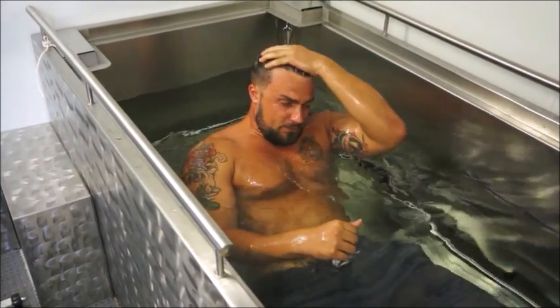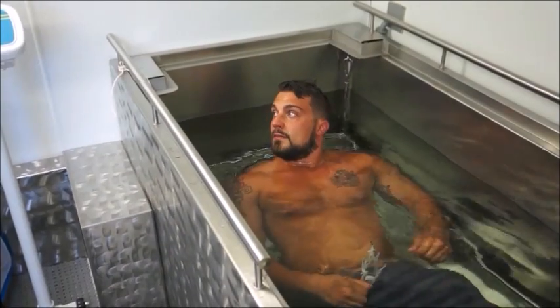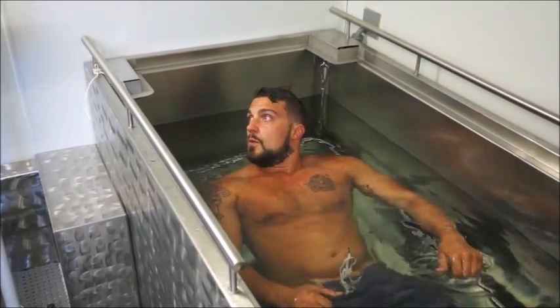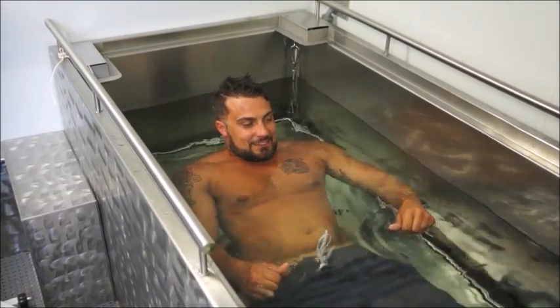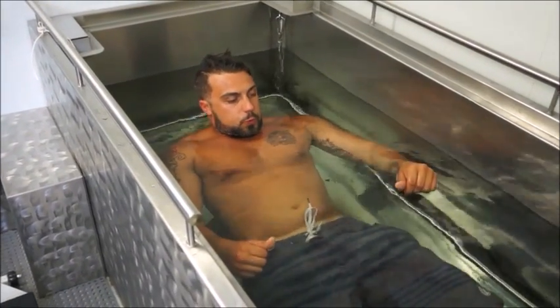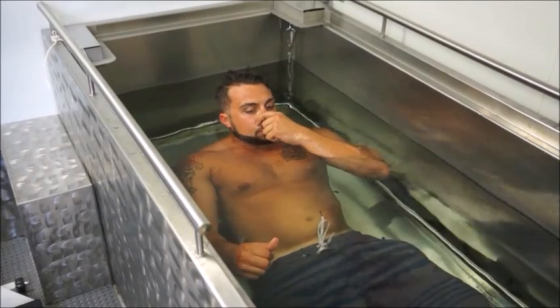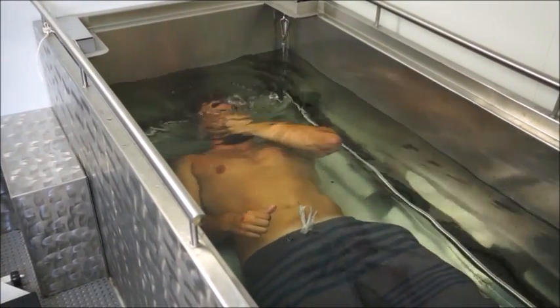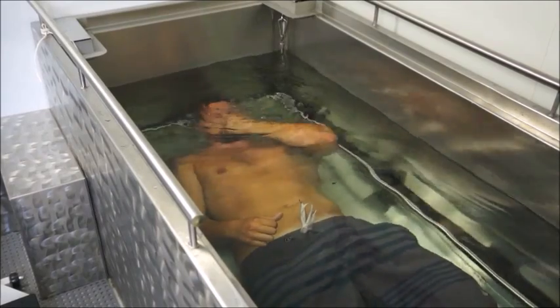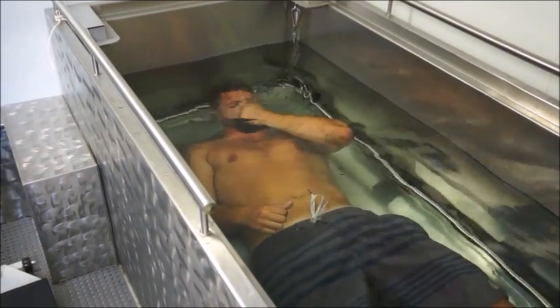Good. How did you feel about that? Good. Do you need any more air out? Yeah, I'll try it one more time and get used to it. For sure. Nice — knees down, just lower yourself gently.